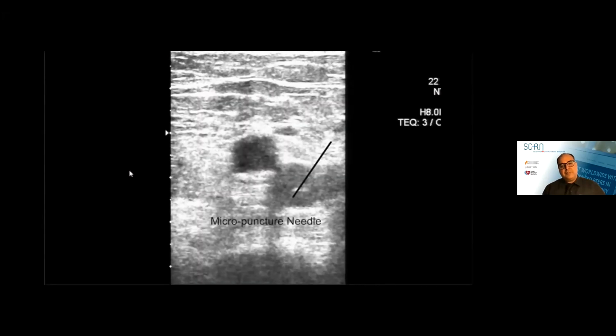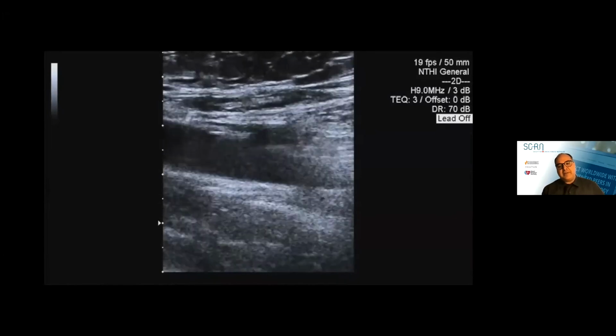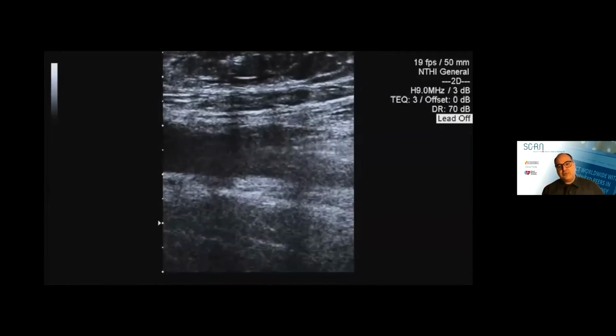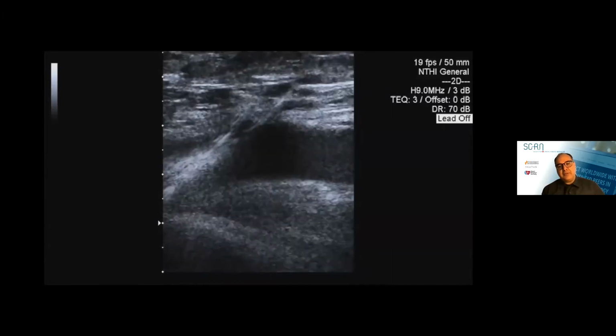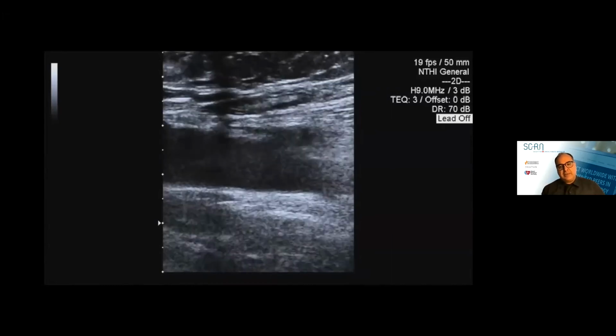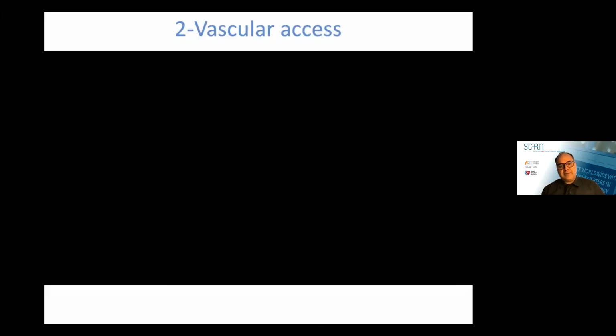So just a front puncture, single puncture site. After that's done, you can confirm that the wires actually are in the appropriate location. You rotate the probe 90 degrees, find the bifurcation, move it cranially, and you see the wires are entering the vein cranial to that. That's very important. I know it's sometimes considered pedantic, but it really does reduce complication rates.